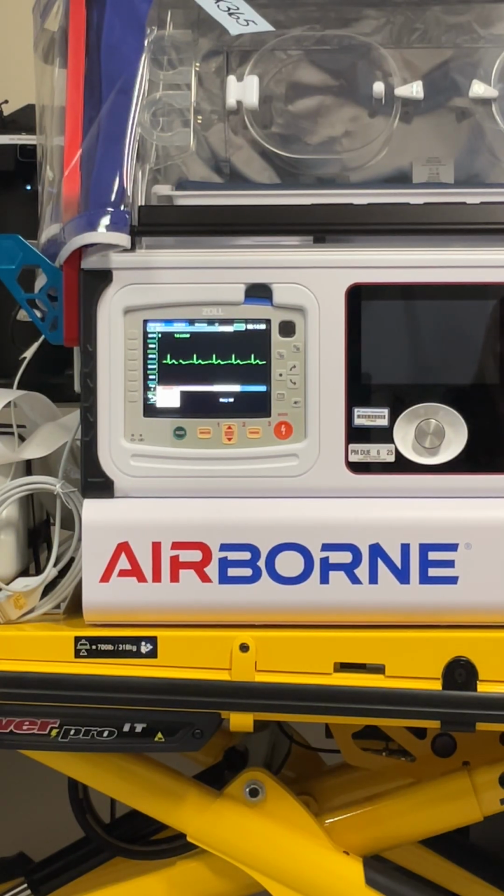Does this monitor automatically update for daylight savings? We did not set clock sync, so it's going to be off when we change time. You'll have to turn daylight savings on or off, which is pretty easy to do. Biomed knows how to do it. Remember, legal documentation is the chart that you write, not your monitor data. We can do clock sync, which pings a server and adjusts the time, but it does not adjust for daylight savings time because not everybody uses it. Arizona doesn't, and other parts of the world don't either.